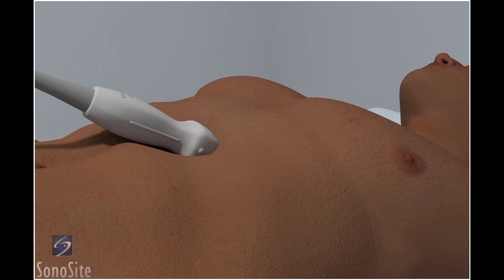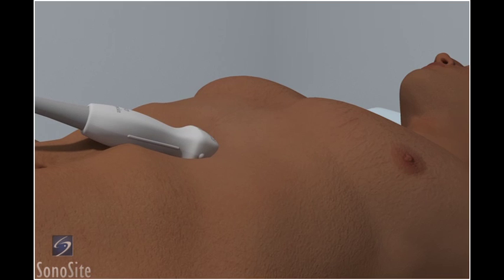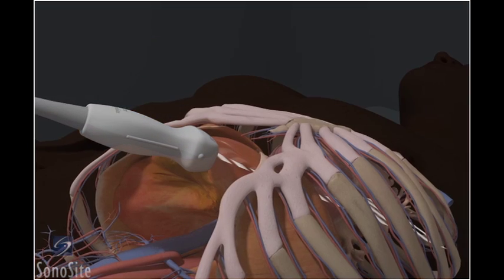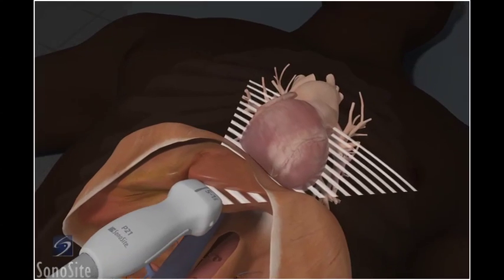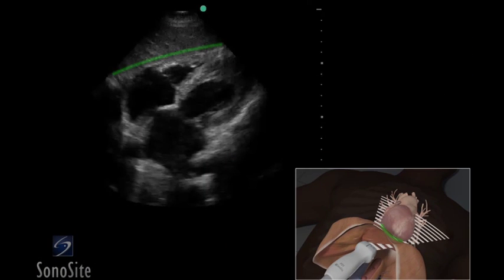In some cases, the transducer is almost flat to the abdominal wall, so the ultrasound beam is directed toward the left chest cavity. A considerable amount of ultrasound gel and downward pressure may be required to maintain contact of the transducer face with the abdominal wall. Having the patient bend their knees helps relax the abdominal wall muscles for better transducer positioning.